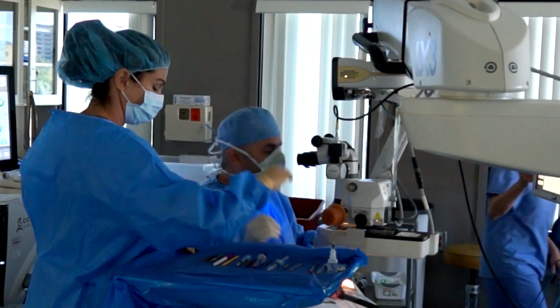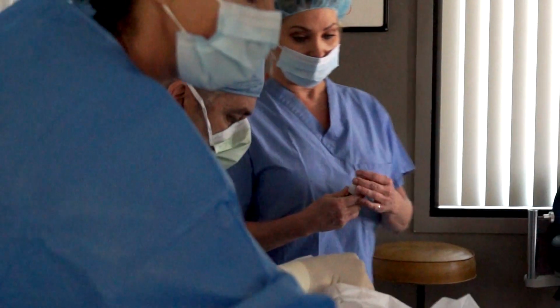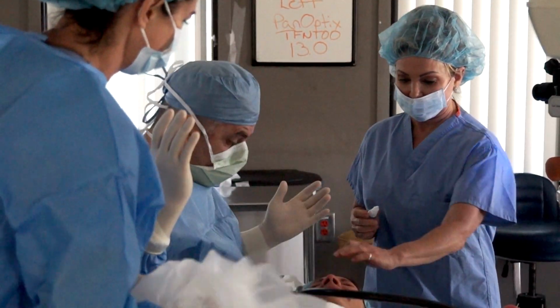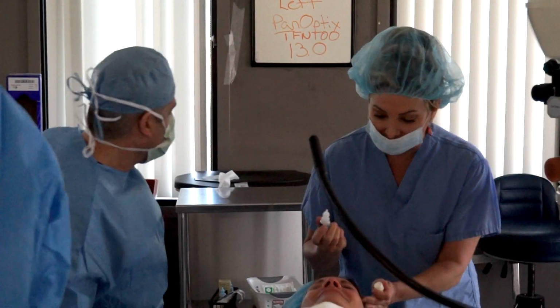For me, it's about 5 or 10 minutes to take out a cataract and put in the new lens, the replacement lens that they're going to see with forever. Once it's done, the patients are almost universally surprised that it's over already, even though we tell them ahead of time it doesn't take more than a few minutes. So I usually tell people if your surgery's at 10, you'll probably get there about 9 and be on your way home by 10:30.